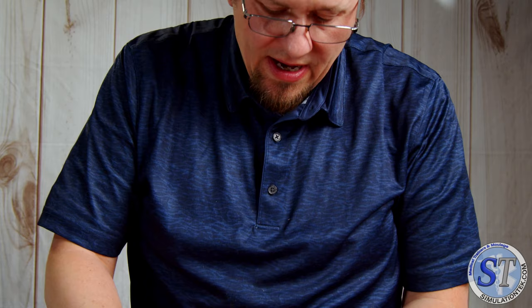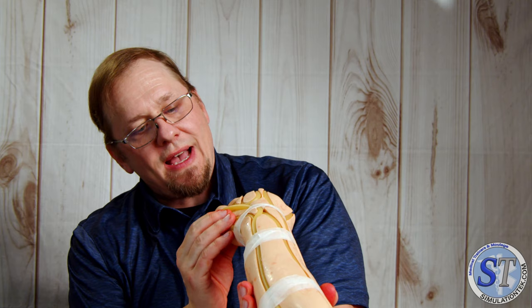So now we've got everything laying down in here nicely, and kick these tubes out of the way. Inspect again, make sure, see, we had one sneak out right over there. And so we want to come back and we want to tape that guy. Looks pretty good. Looks like everything's kind of tucked under. That one there is a little bit problematic, but I think it's under there enough, it should be fine.